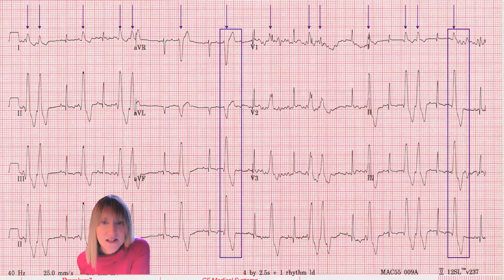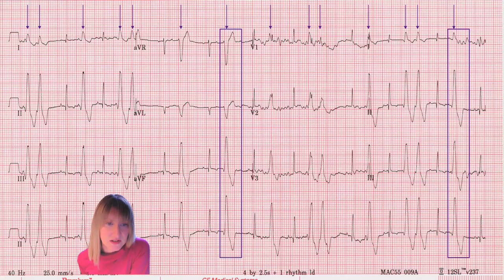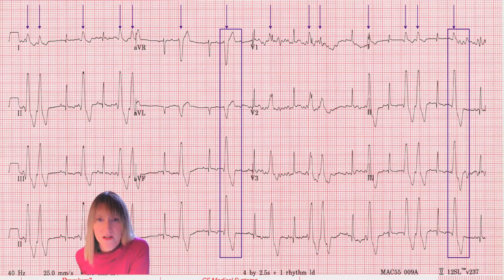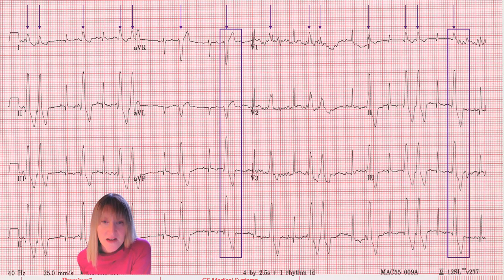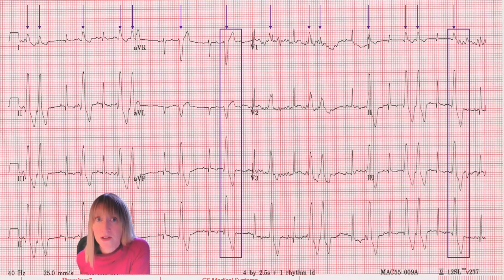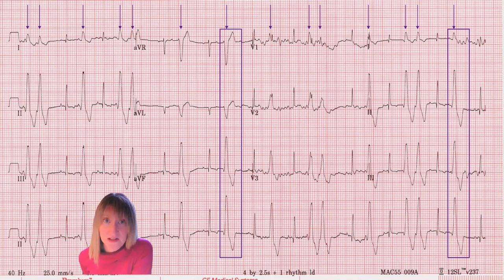Now let's test our knowledge. I have another ECG here from a boxer. The top three lines are multiple leads — all nine leads: six frontal plane leads plus three chest leads, V1, V2, V3. Along the bottom, the fourth line down is lead two all the way across. I've depicted the PVCs as the beats that have arrows pointing to them, so if you cast your eye from top to bottom, you can see in multiple leads what those PVCs look like. I've also put a box around one example of a PVC in the augmented leads AVR, AVL, AVF on the left, and a box around what the VPCs look like in leads one, two, and three on the far right. The heartbeats immediately to the left of those PVCs in the boxes are the normal sinus beats, and those normal sinus beats have a normal MEA.